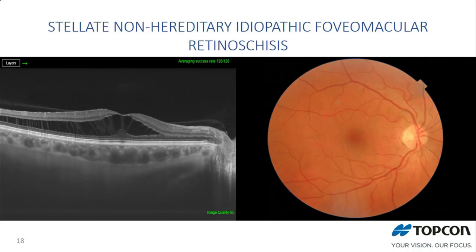And the reason for that is that you see these columns of Mueller cells. These are clumps of Mueller cells that create a protective tube around bipolar cells connecting the inner and the outer retina. Now, theoretically, we're working together with John Marshall on some ideas. You might be able to predict the visual outcome after therapy based on the narrowest area of the Mueller cell columns.